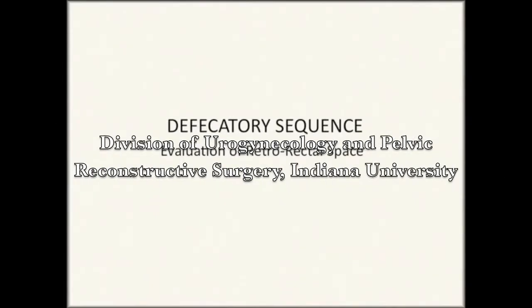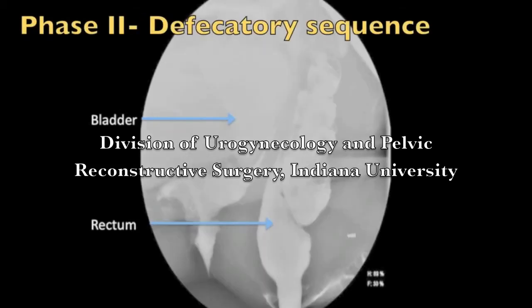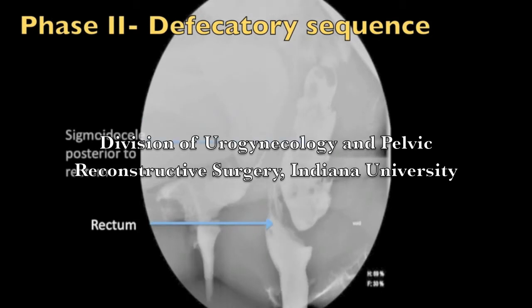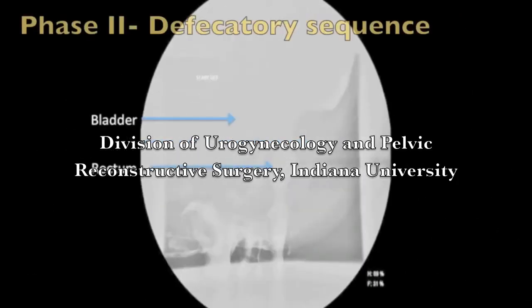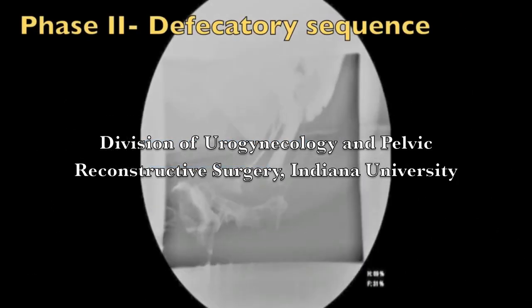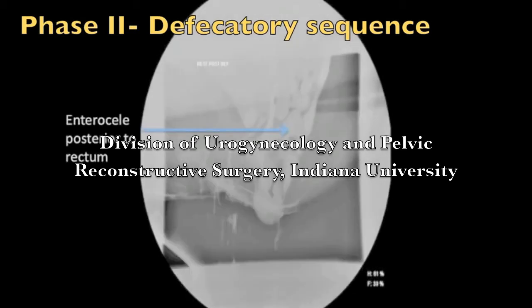Similar to the rectovaginal space, the retro-rectal space can also be difficult to evaluate during physical exam. Prolapse into the retro-rectal space has not been well described in the urogynecologic or colorectal literature. This is a patient with a chronic history of rectal fullness and difficulty with bowel movements whose physical exam was normal, and whose straining image on DCP was also normal. The defecatory sequence, however, shows a large sigmoidocele posterior to the rectum in the retro-rectal space. In another patient, a large rectal prolapse with an associated enterocele in the retro-rectal space is seen.